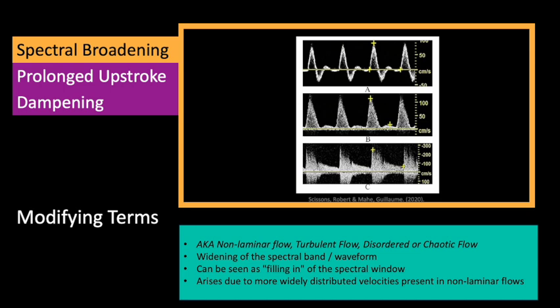I hope that you can see that in the very top tracing, we see that there's almost one distinct line. We still have a little bit of fuzziness, but you can see these little windows underneath the peaks in systole, and even in the diastolic peaks that are below the line, you see there's an area where there's no fuzziness, there's no pixels, there's no white, it's all black.